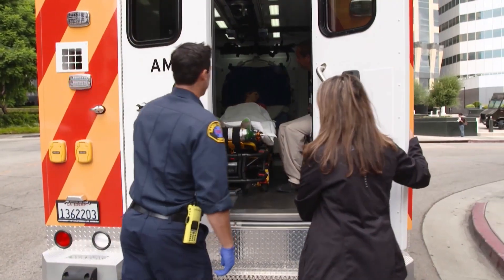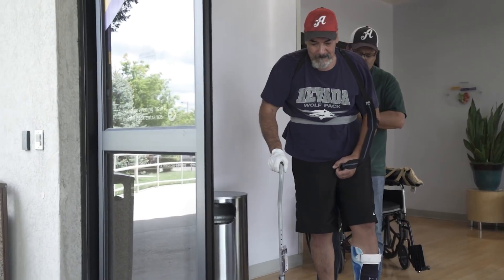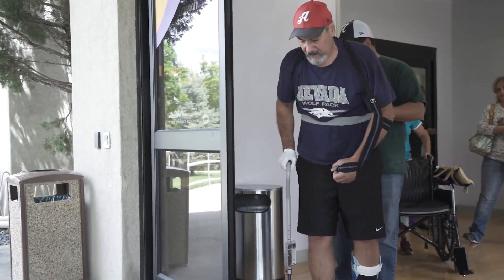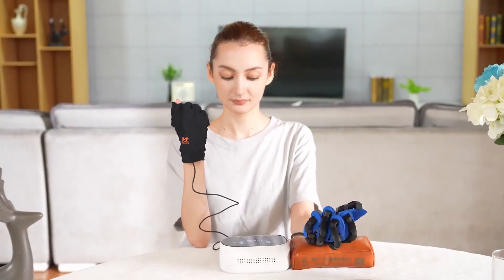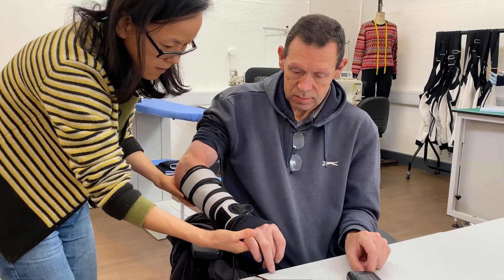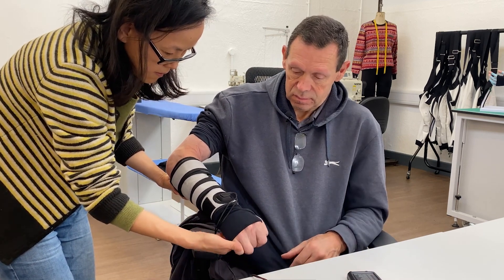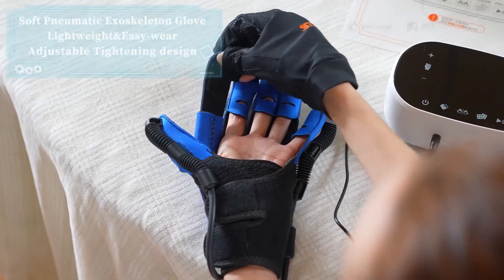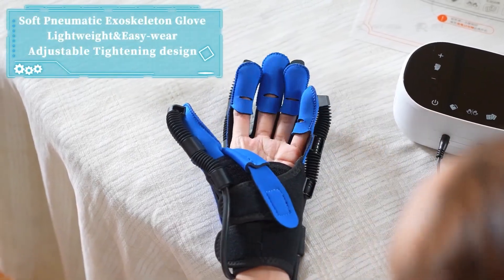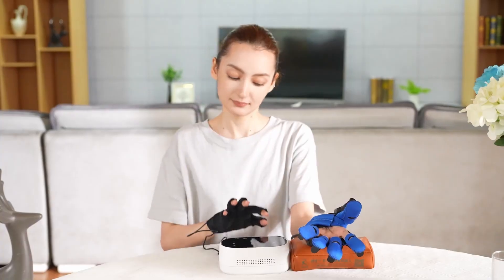According to the World Health Organization, stroke is the second leading cause of death and the third leading cause of disability globally. The SmartGlove can potentially reduce the burden of stroke on individuals, families, and health systems by providing a low-cost, accessible, and effective solution for hand rehabilitation. The SmartGlove can also empower stroke survivors to take charge of their own recovery, and motivate them to achieve their goals.